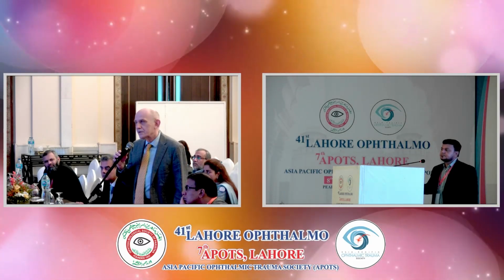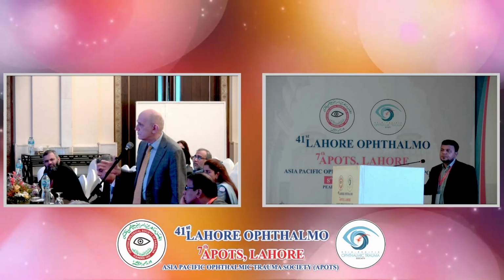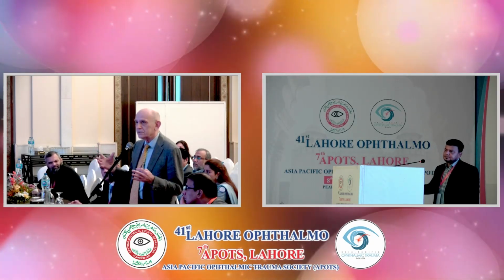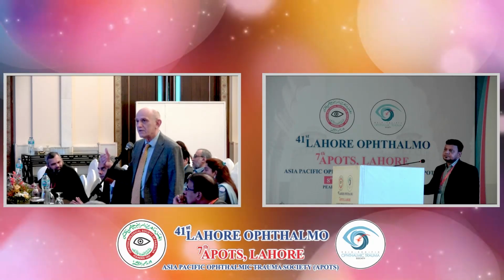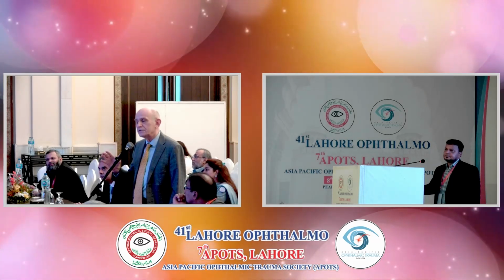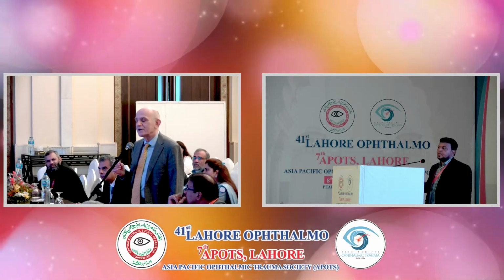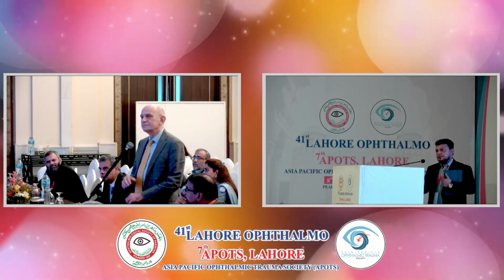Is it 16% or 20% C3F8? Generally, 20% we make. Generally use 14%, yeah. But 20 is too much. Yes, 20 is expansible, it's not isovolumetric, it will expand. So you will get higher intraocular pressure. I'm just wondering if that's what you want. We usually use a 16 to 20% mixture because the exact mixture is very difficult to make in our circumstances.